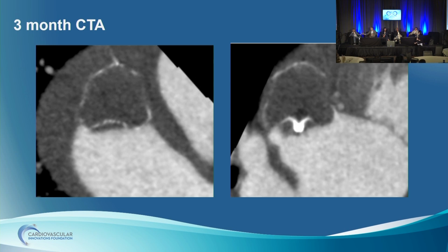I probably would feel comfortable going to DAPT at this point. So 1 vote for DAPT. I would also go to DAPT. I think this is a reassuring CT. So 2 votes for DAPT, 3 votes for DAPT. But also I think that reformatting these images and looking en face at the whole left atrial surface of the device might help us with determining the clot burden.